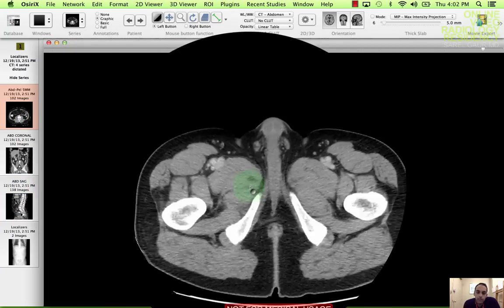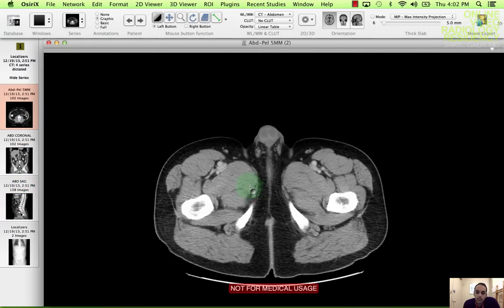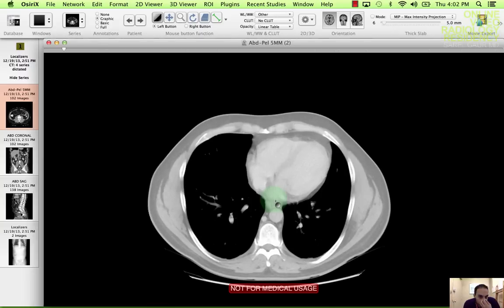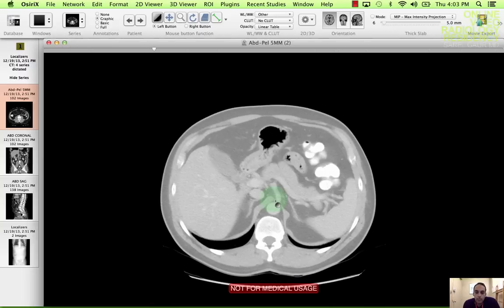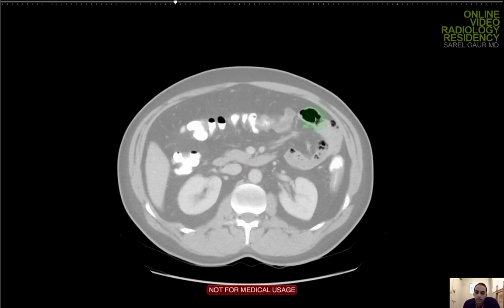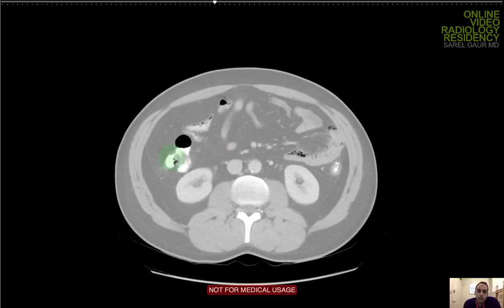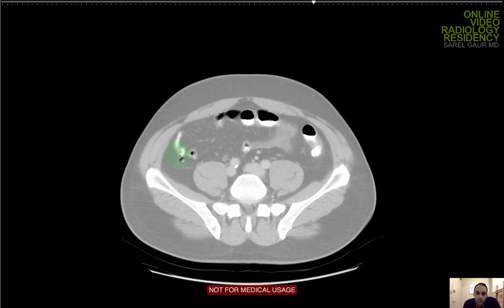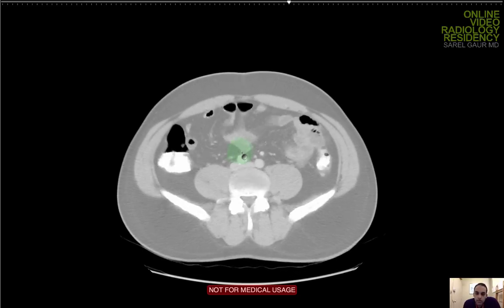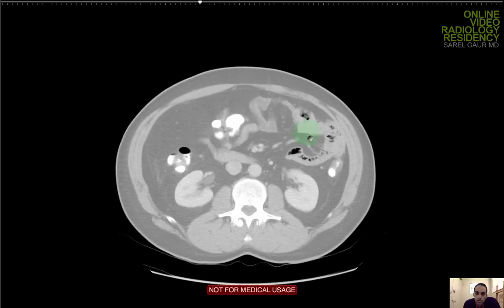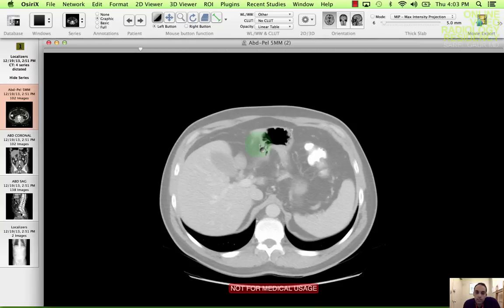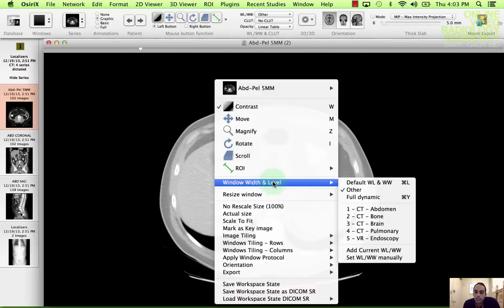After looking for free fluid, I'm looking for free air. I'm going to widen the window and increase the window level. As I'm coming down, all this dark air I'm seeing should be inside a bowel loop — none of it should be outside. I'm looking and not seeing any air outside the bowel loop. So there's no free air. That's helpful — you'd see free air in a perforation or after a recent surgery.